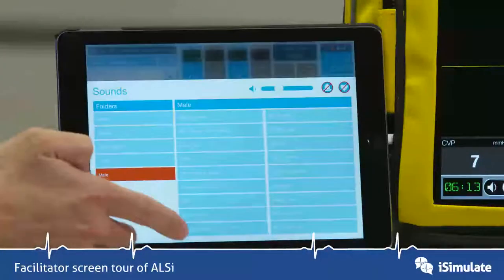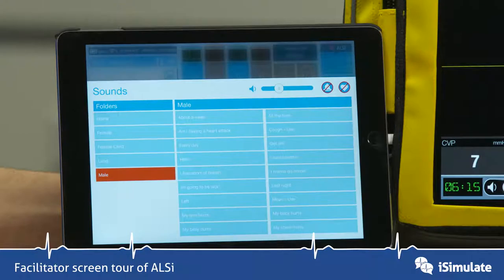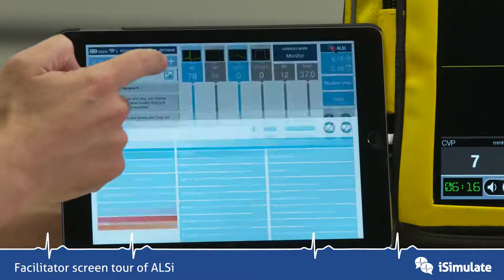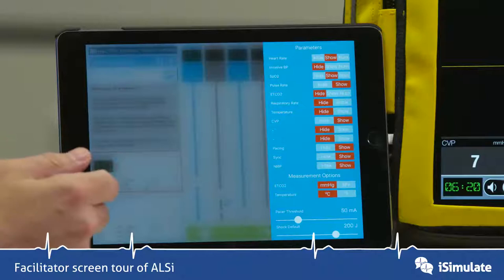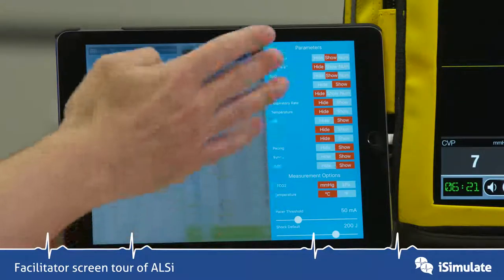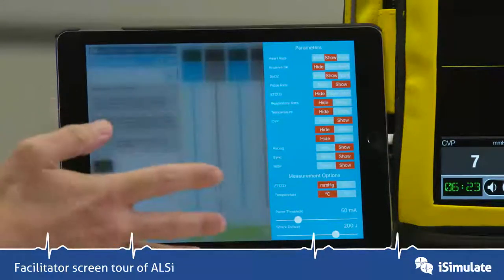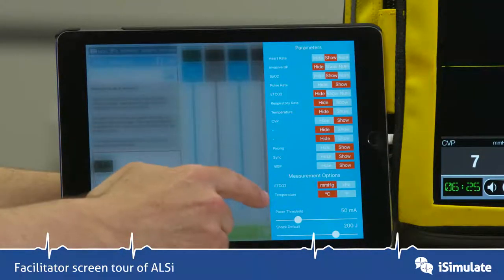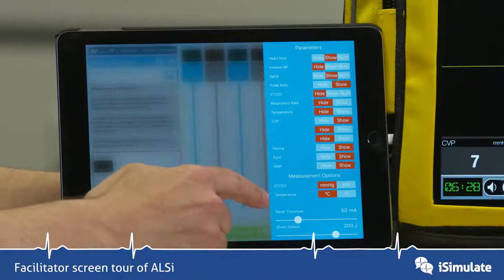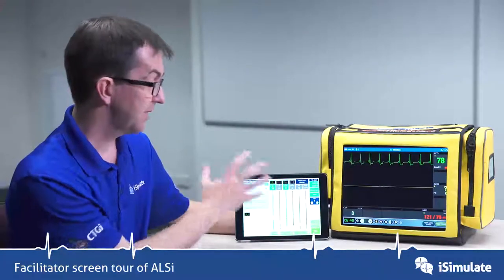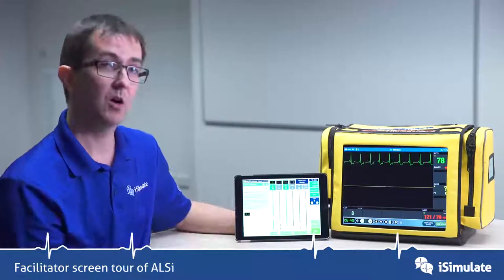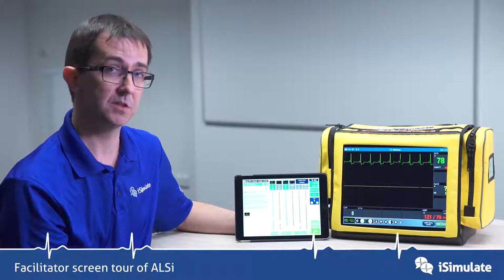There's a whole sounds menu that appears here as well. Options let you do some very bespoke changing of what you can hide and show on the screen, plus it includes end tidal CO2 and temperature unit changing, and you can also change the pacing threshold and shock default. So that gives you an idea of what you can do on the facilitator screen.